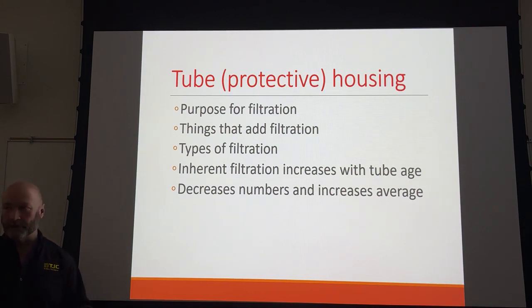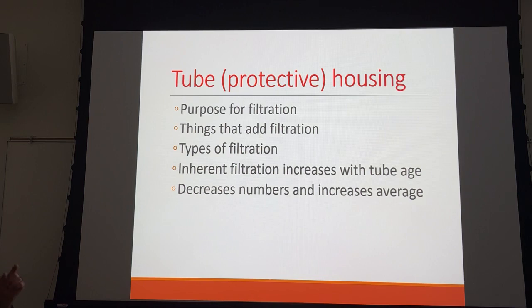Still inherent filtration. Even though you added that, it's still inherent filtration because you have to have 2.5 millimeters of aluminum to legally make an x-ray. Okay, so that's the definition of inherent filtration that we're going to use. If you can't take it away and legally make an x-ray, then it's inherent filtration, right?